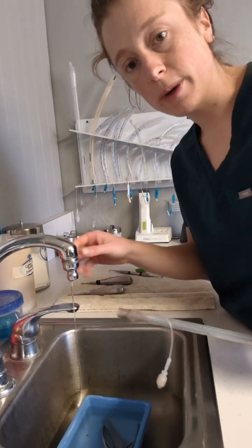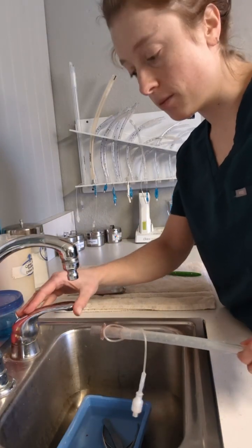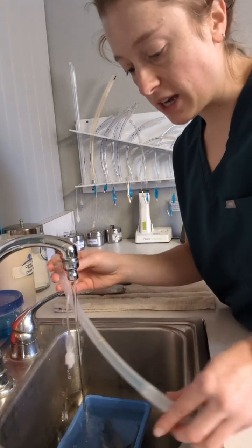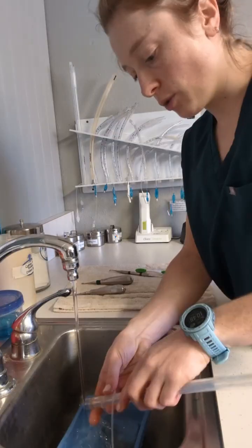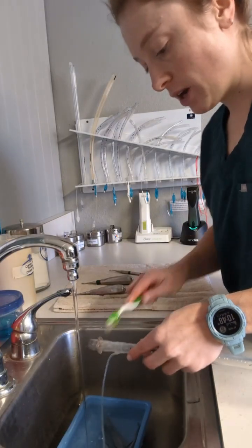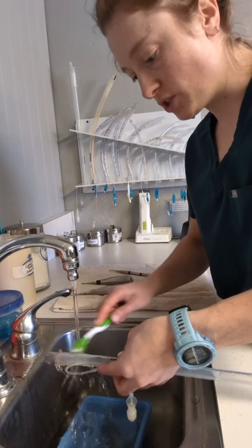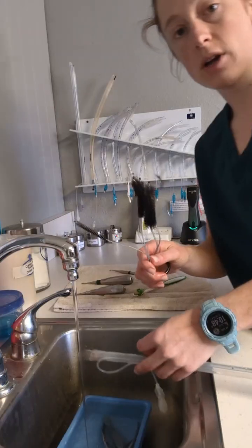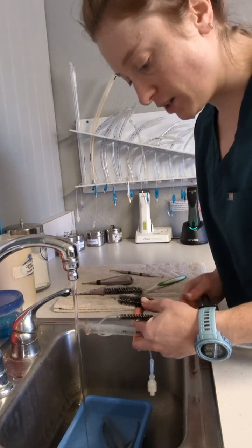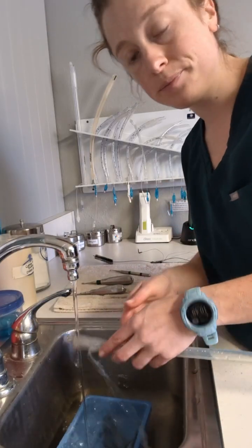The endotracheal tube ideally doesn't have any cleaning products on it. They can break down the plastic of the endotracheal tube. So I'm just going to give it a really good rinse, a really good brush inside and out. So I've got a toothbrush for the outside, and then I have brushes for the inside. I just want to make sure I give it a really good scrape and then let that dry as well.